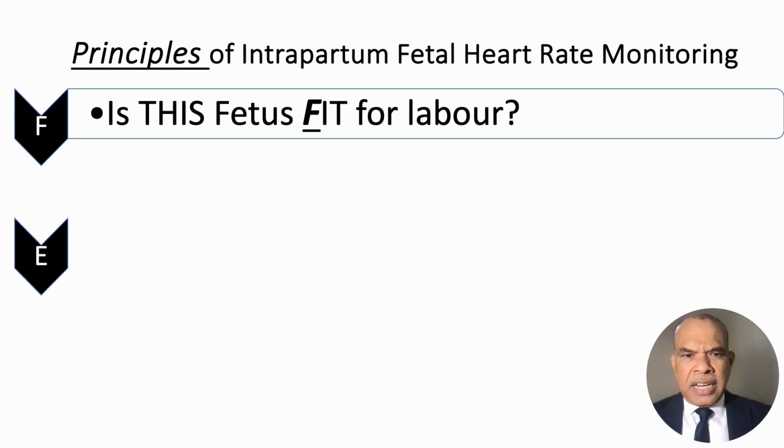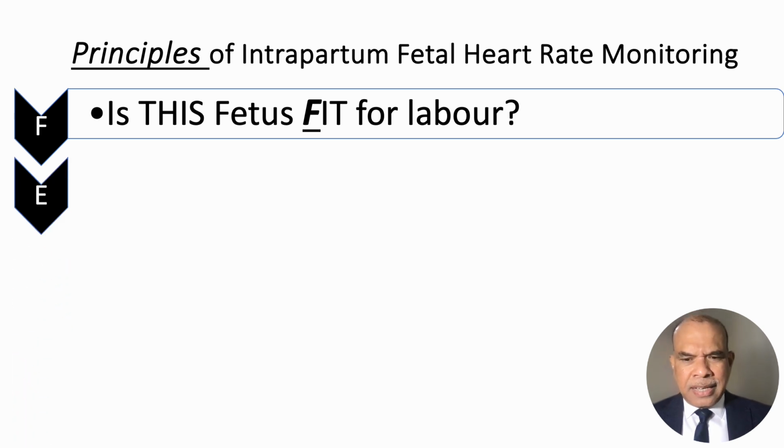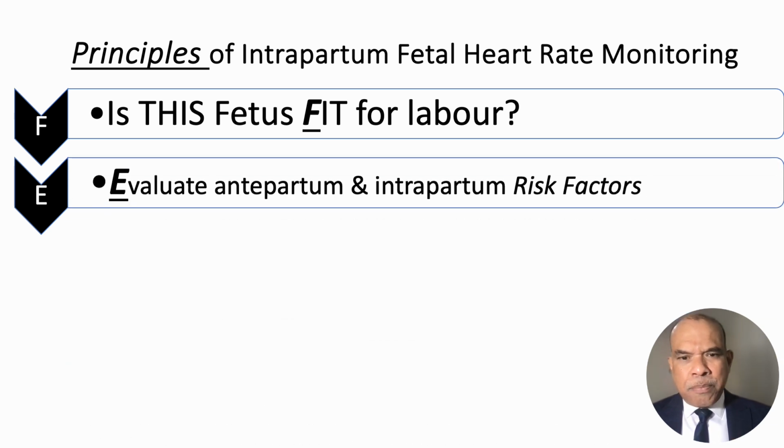So intrapartum fetal monitoring is a journey that we are monitoring, and CTG is just one part of the journey. The questions we need to be asking at the beginning of labor: is this fetus fit for labor? We are going to do part 2 of this presentation based on those tools.